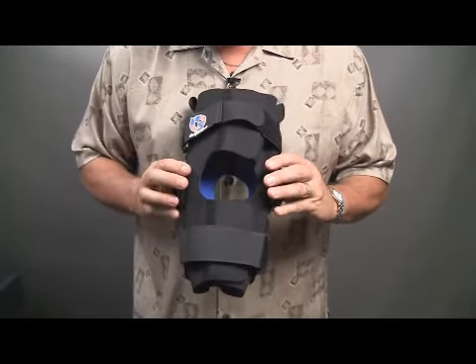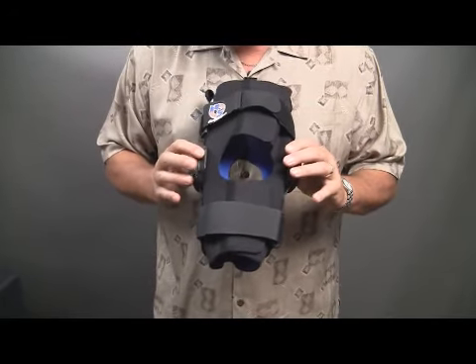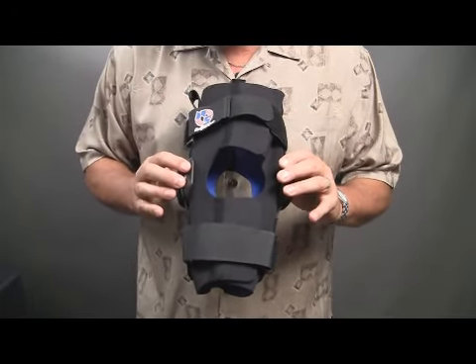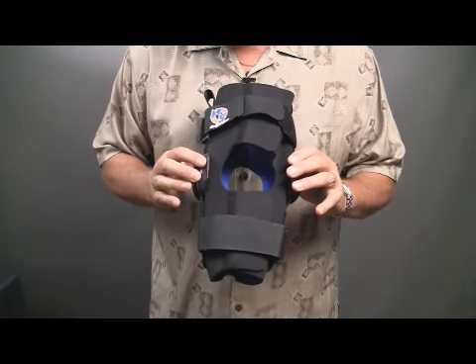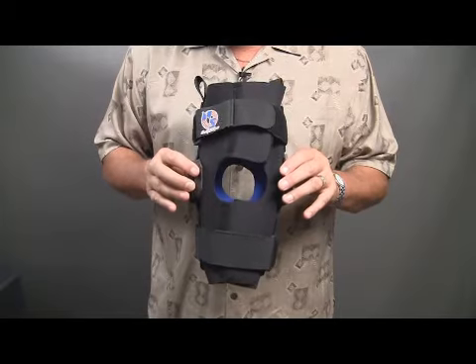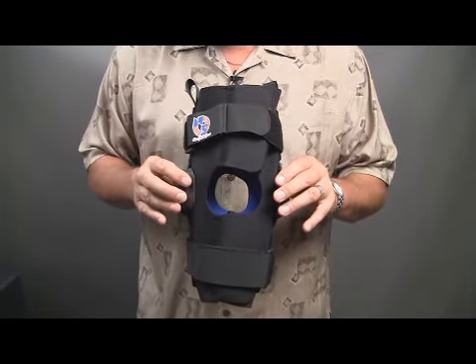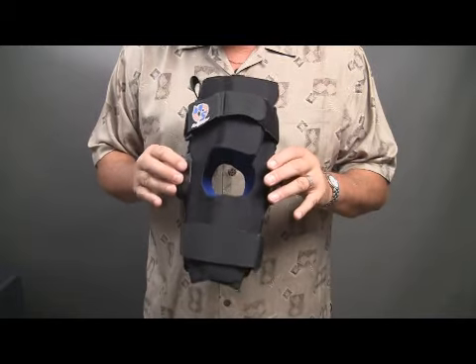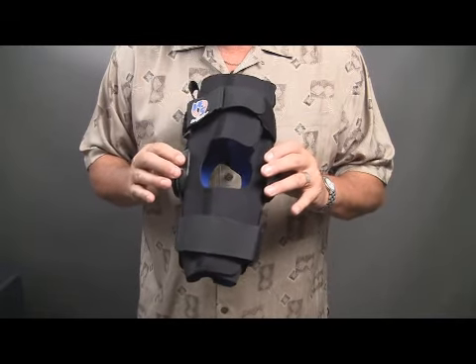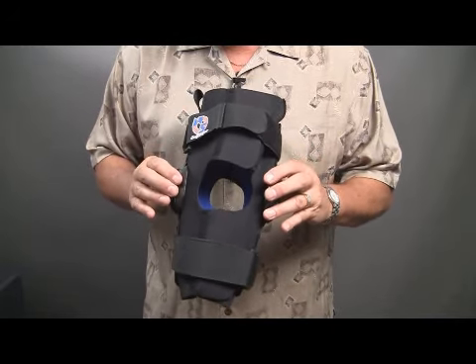This brace also comes in CoolFlex material. This is a 13-inch brace, but it comes in neoprene or CoolFlex. The CoolFlex is a breathable space knit fabric that you can wear all day comfortably. The neoprene will generate warmth and a therapeutic effect, but there are times when patients prefer the cooler version, so this is available in CoolFlex.